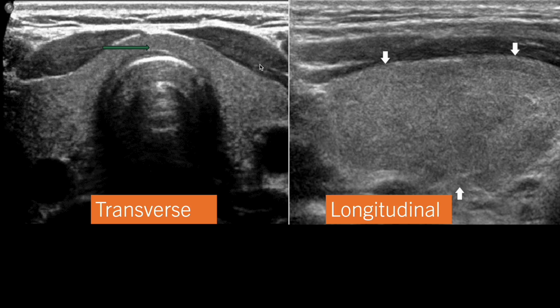The thyroid gland is normally hyperechoic and homogeneous. This entire hyperechoic structure is the thyroid gland. In front of the thyroid gland we can see this hypoechoic structure — these are the strap muscles. There are two strap muscles on the anterior aspect of the thyroid gland: the sternothyroid muscle and the sternohyoid muscle. On the lateral side of the thyroid gland we can see the carotid vessels.